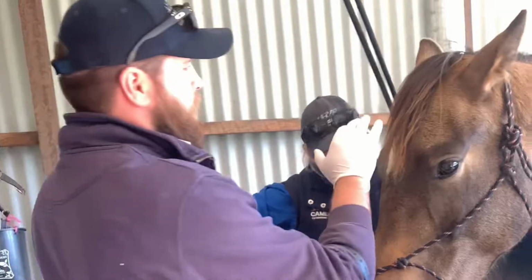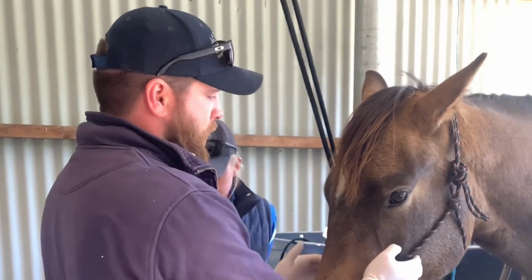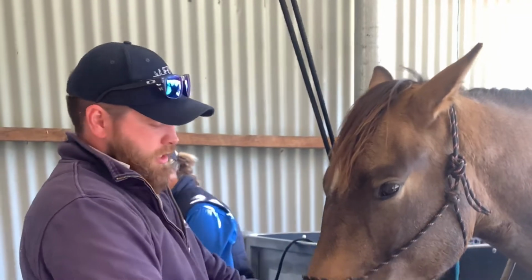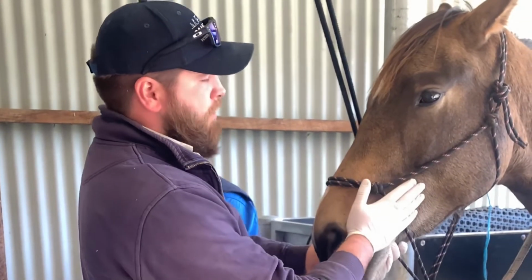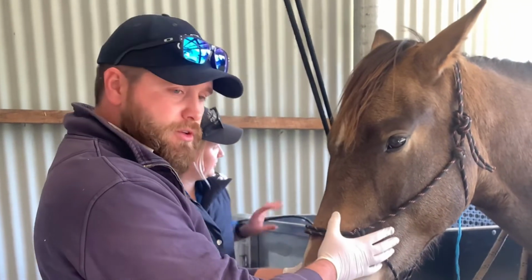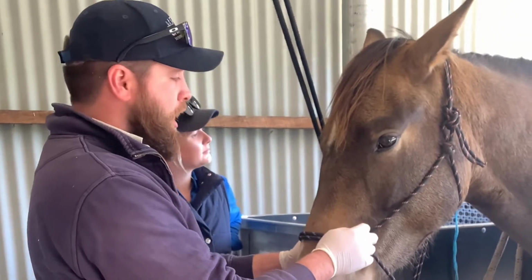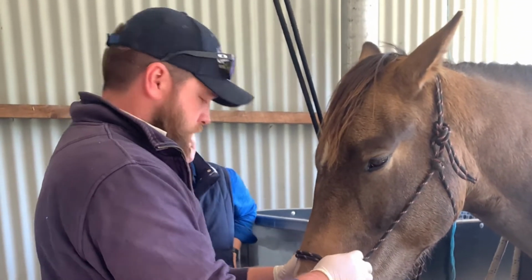So we always start off with a bit of a distance exam. When we're looking at the horse, we want to look for external signs of swelling and discharge. Do we have any discharge coming out of their nasal cavity? Are they balling up feed? Owners will help us with answering this as well. Are they dropping food while they're eating? Are they having issues with a bit in a particular direction? Or are they just in general a routine checkup?